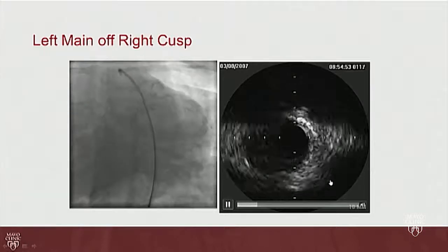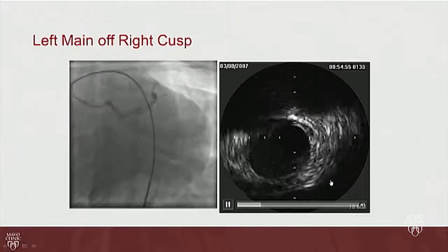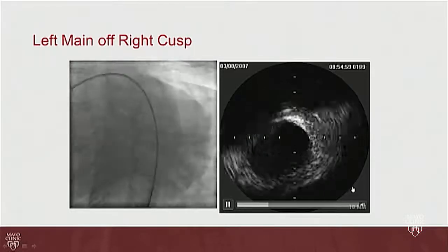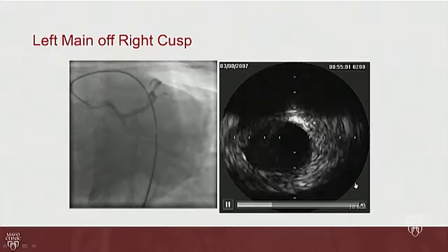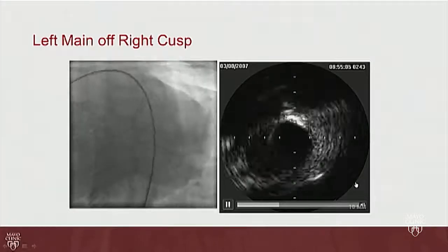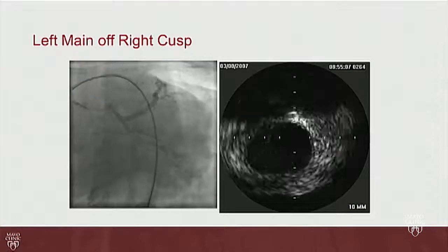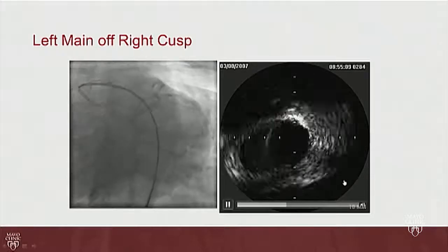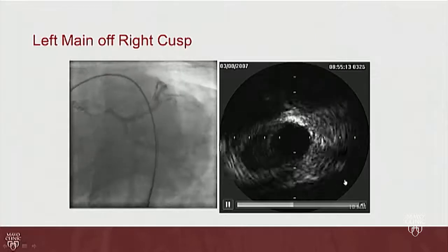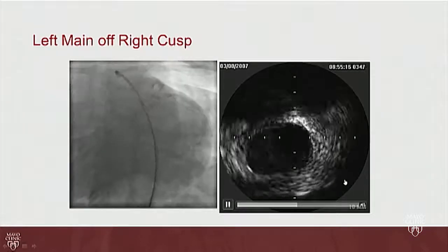And if I'm patient through it, you will start to see it compress further out as we go. It never truly looks completely slit-like, but you can definitely see that there's some compression to it.